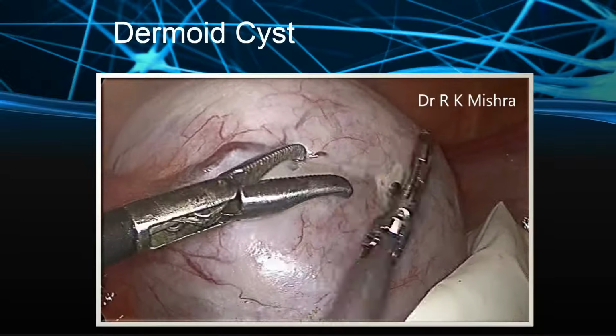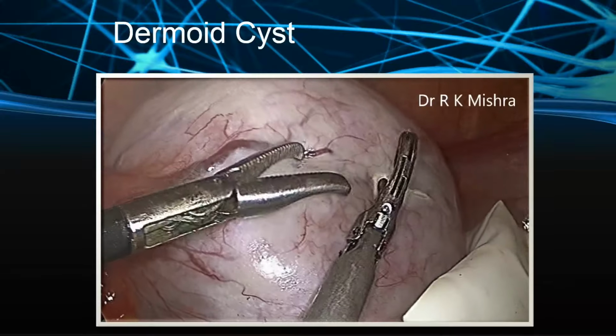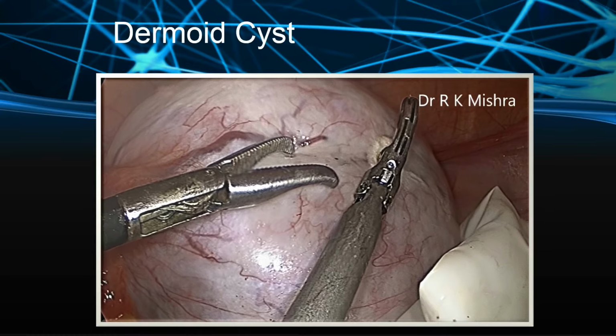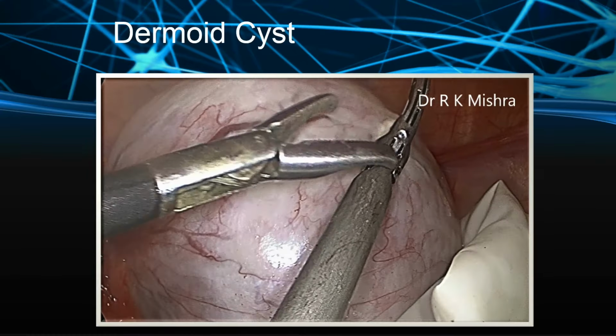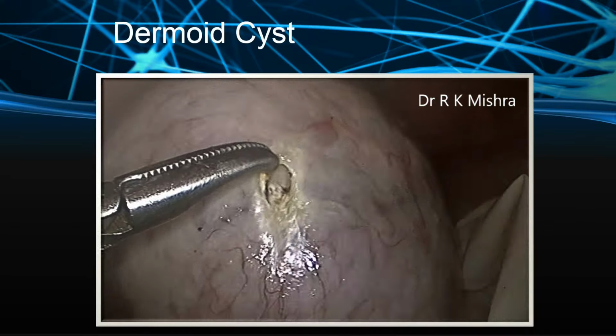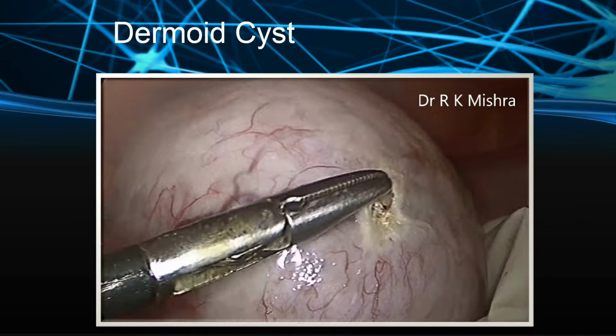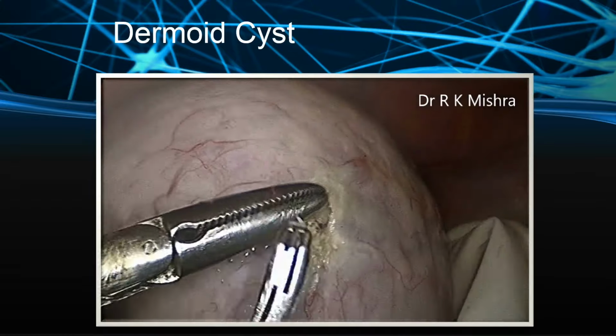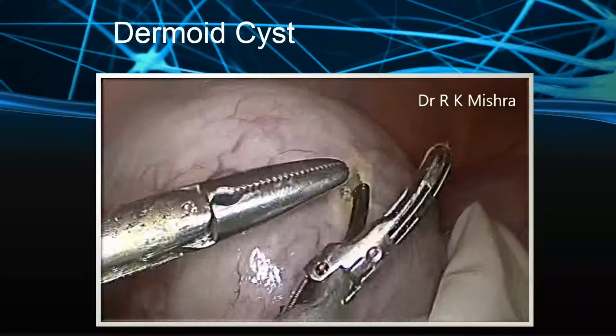Just like when you have to remove tiles from the wall with a hammer, first you do the knocking, so that it will loosen and leave the plaster, and then you remove it. Exactly the same way, knocking with the harmonic can break the hydrogen bonds, and it makes a beautiful bleb which can be held.